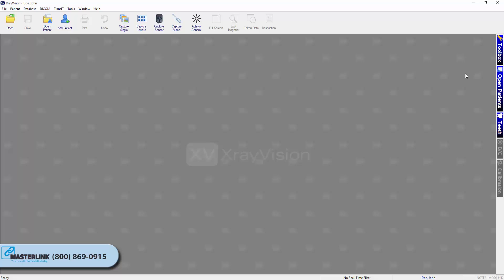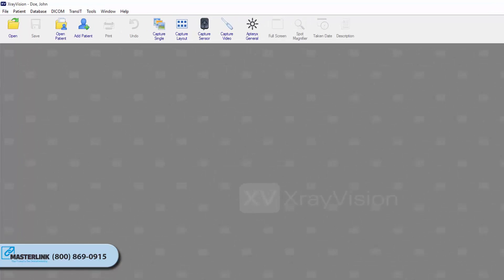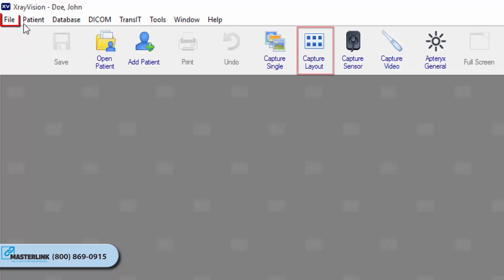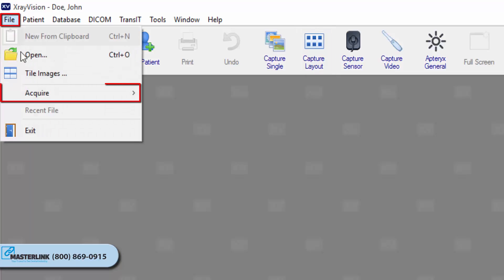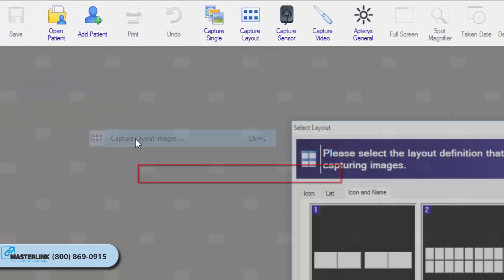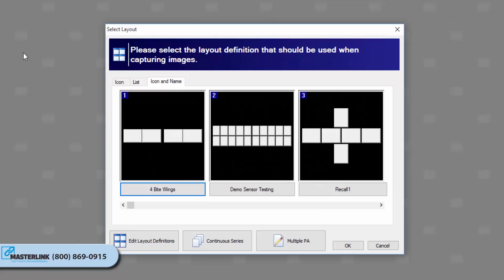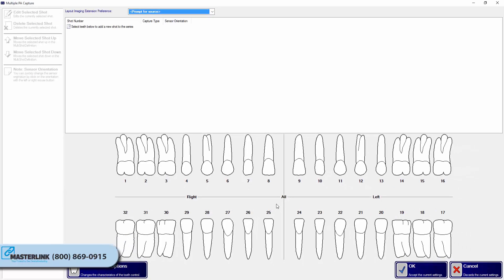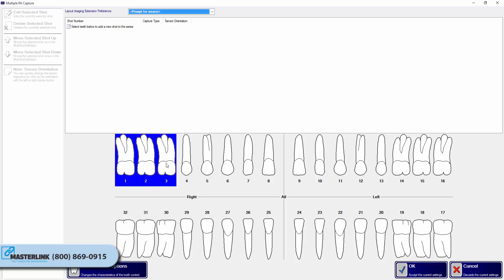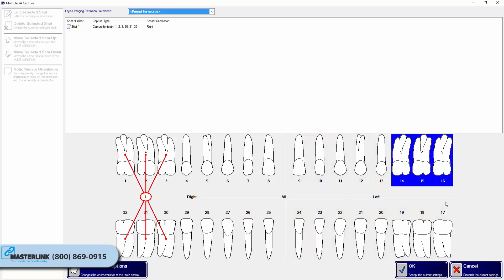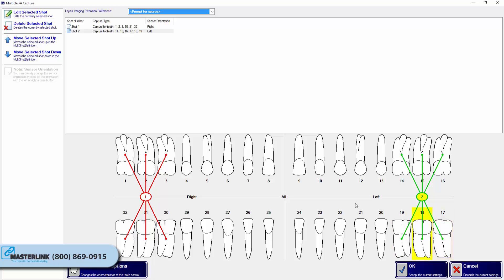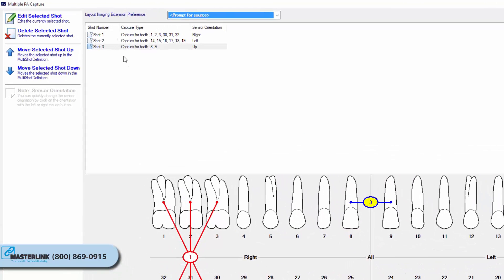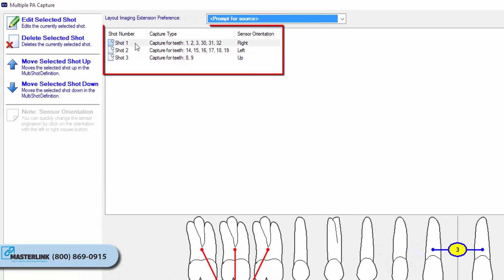To initiate a Multiple PA Series capture, click the Capture Layout button on the toolbar, or select File, Acquire, Capture Layout Images. The Select Layout window will appear. Click the Multiple PA button at the bottom of the window. The Multiple PA Capture window will appear. In this window, the user can create shots by clicking on a single tooth, or by clicking and dragging over multiple teeth. The selected shots are then placed in a series list at the top of the window.